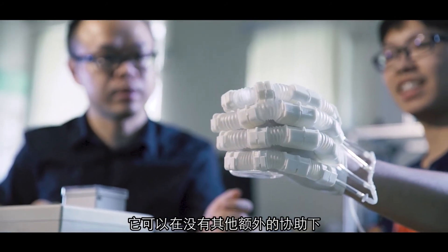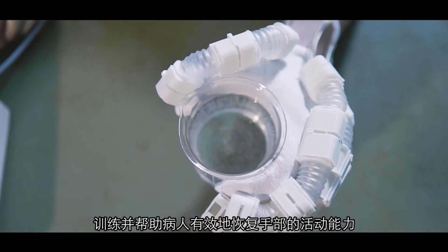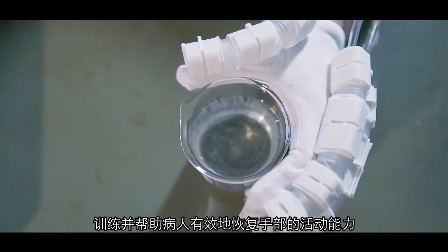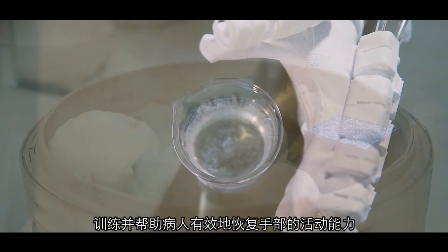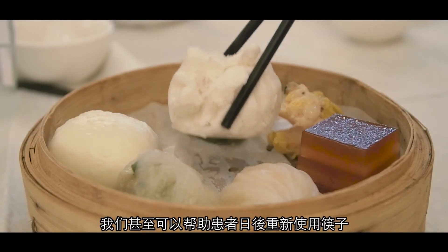The use of this new technology can help us to improve rehabilitation very well. It can train and rehab their hand much more efficiently without any extra assistance. We can even allow patients to use chopsticks in the future.